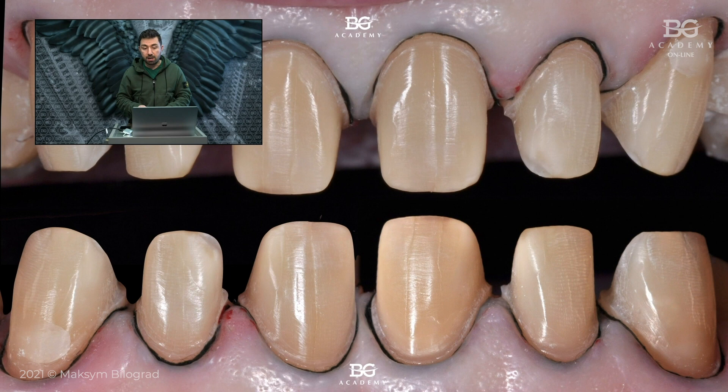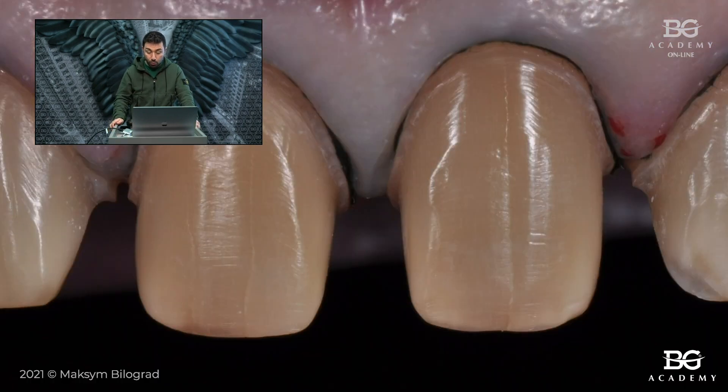This is how the teeth looked after preparation, and I was pretty proud of that outcome because a lot of enamel was preserved, which is good for bonding. The preparations for full crowns here are pretty minimally invasive. The good thing is that nowadays we can do minimally invasive preparations for bonded restorations, especially for pretty strong restorations like Emax crowns.